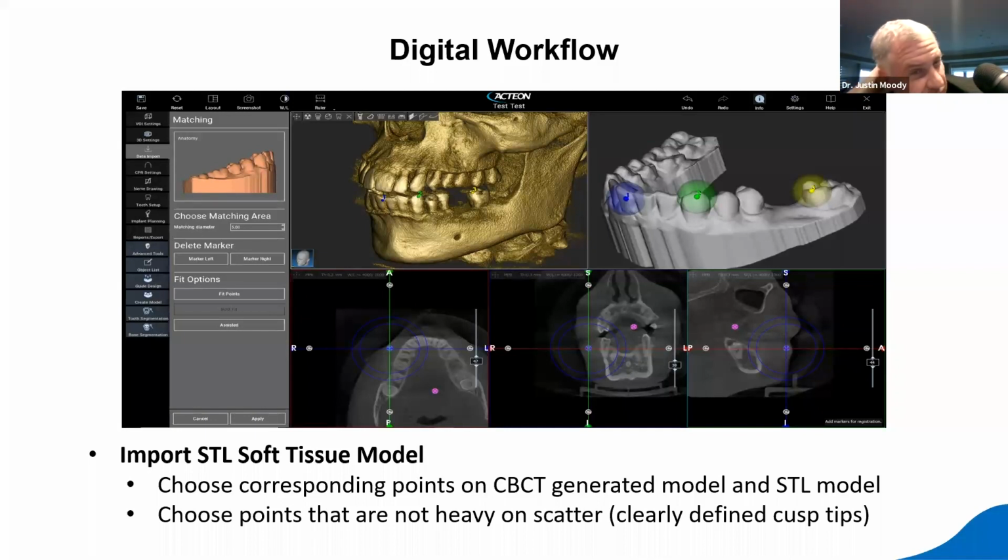Now sometimes this is hard to avoid, because if you've got a patient that's got a lot of metal already in their mouth, especially like a full mouth rehab of PFMs, it's going to be very difficult to find this. And just know that there is no magic cone beam that only sees the teeth and the bone and doesn't see metal. That just doesn't work. Now, your salesman will always show you their finest ConeBeam CT and always show you their opponent's worst ConeBeam CT. Just know that it's important to have a ConeBeam CT.